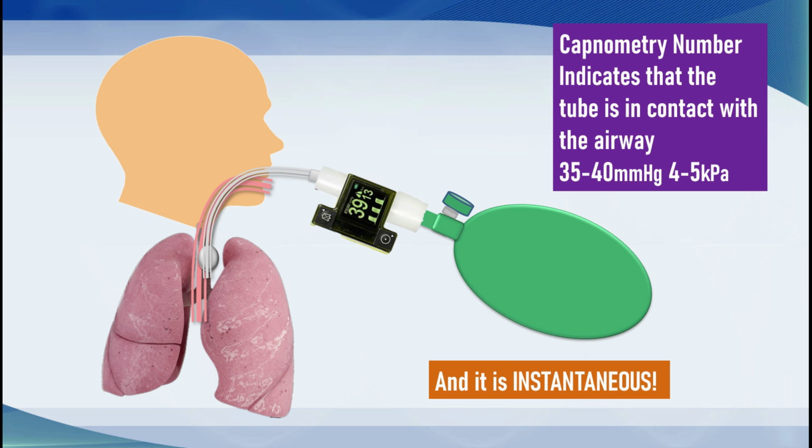It's obviously lower if the airway is supraglottic or the cuff ruptured or not inflated; the end tidal CO2 may be lower than expected due to gas leakage. Best of all, with these devices, the result is instantaneous. And that's the big value of mainstream analyzers. Every anesthesiologist will tell you that the standard side stream gas analysis device that we use in the operating room incurs a delay where time seems to stand still as one awaits the waveform display.